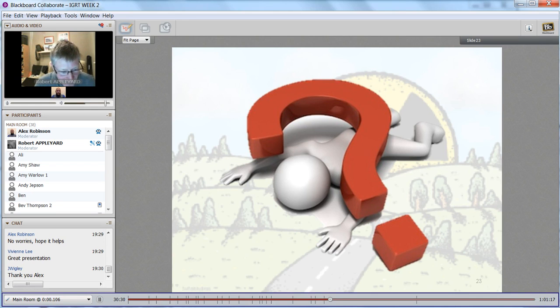But I'm going to start with something that Ben raised. I asked whether MIP, maximum intensity projection, was something that most people used as a way of generating the internal target volume. Because I think most people do, but those that perhaps don't work in pre-treatment, or those that are in the process of implementing 4DCT may not know much about it. So, do you want to just explain a little bit more about MIP and the process that's involved?